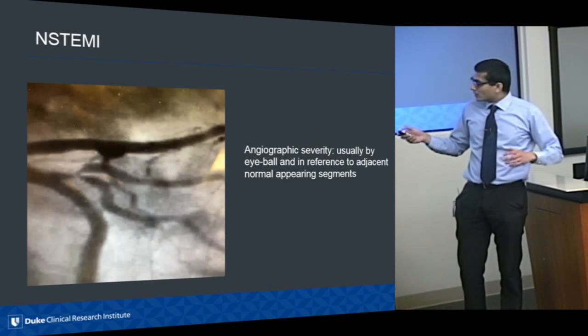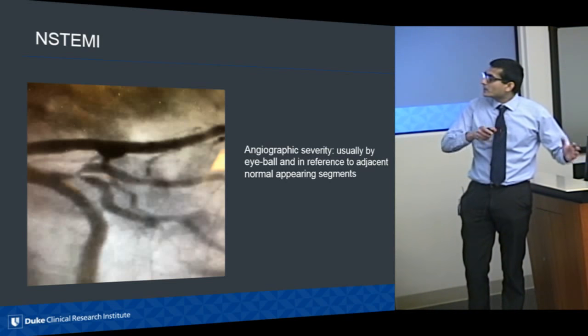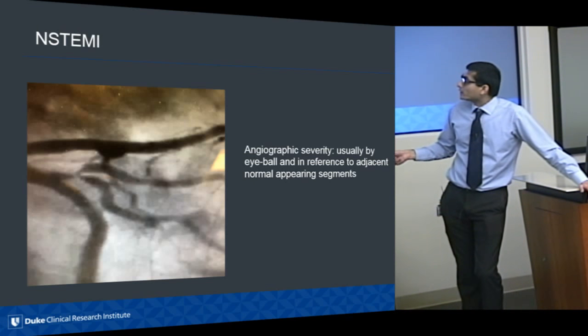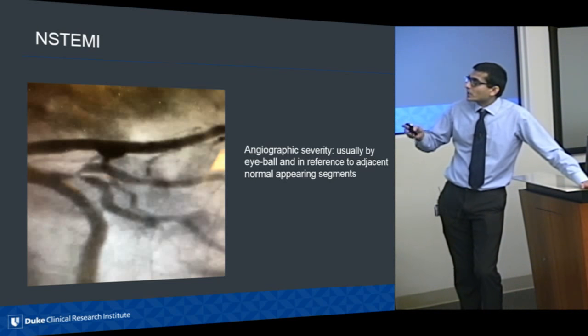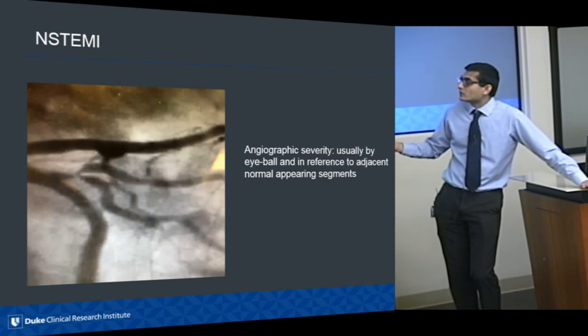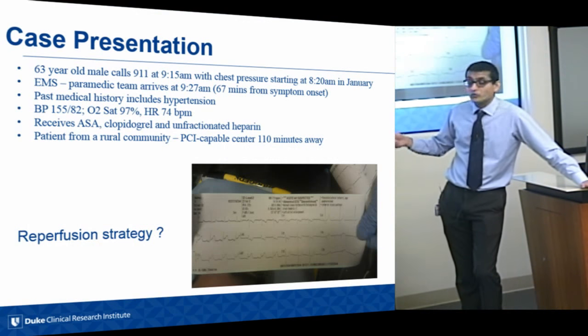And in contradiction to the STEMI is this patient with a non-STEMI, and again here a left coronary artery that shows a tight, really tight stenosis, usually preceded by plaque rupture, but past that stenosis is normal flow going down both branches. So clearly showing us that in STEMI, the artery is completely occluded, while in non-STEMI, there's usually normal flow going past that narrowing.